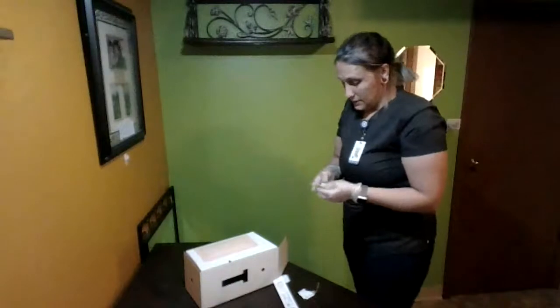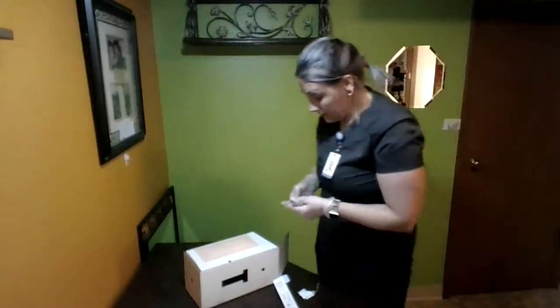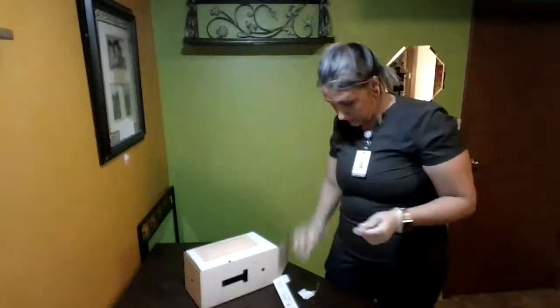Okay, so now that I have that up in my 25 gauge 5/8 of an inch needle, I'm going to inject it into their skin.